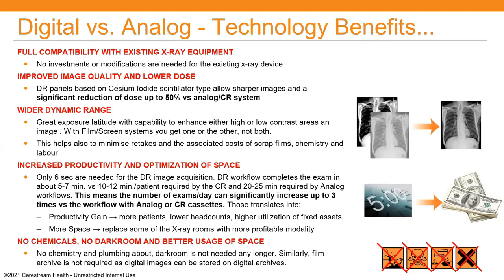Also, no chemical, no darkroom. The hassle of working with chemistry these days: many countries have regulations that are really limiting the transportation, and when you have to dispose of the chemistry, there are very restrictive laws. So all of these will disappear if you move to digital. Let's move forward.